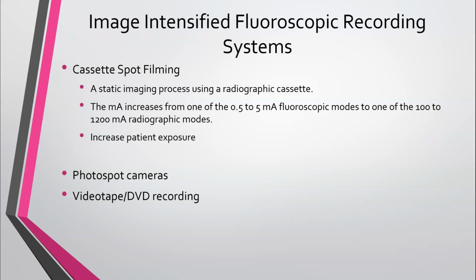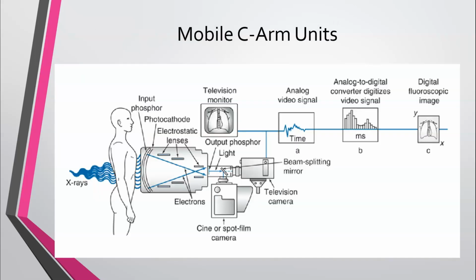So it takes the machine a second to do that. When you do this, you're increasing your patient exposure by a lot. There are photo spot cameras, and there's videotaping and DVD recording also.